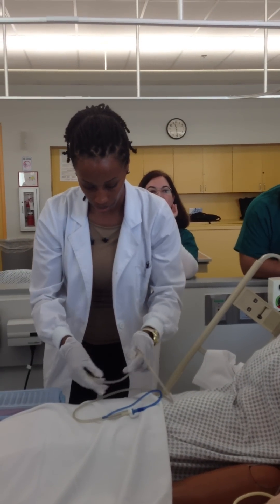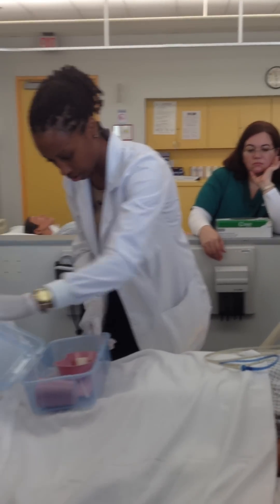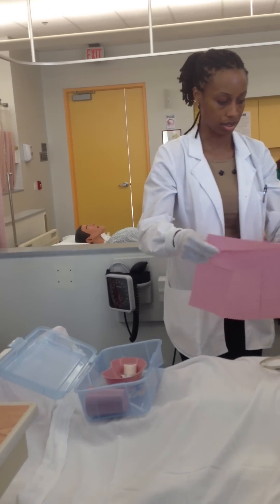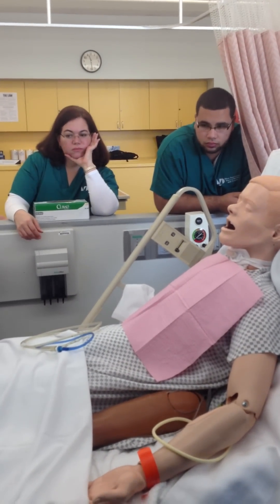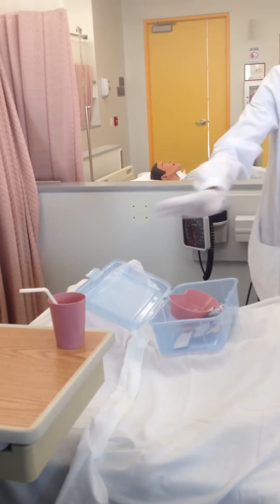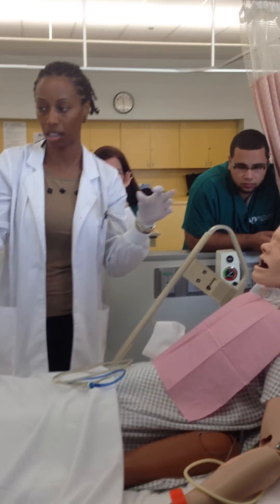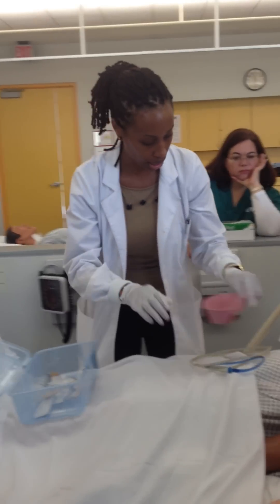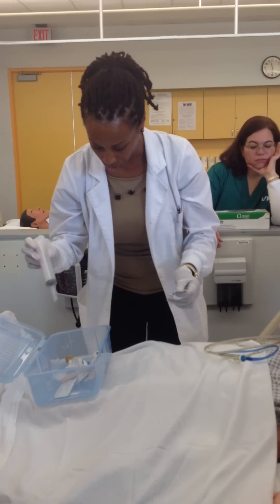This is clean, so you have it on the patient. If you have a towel, you can set it on top of the towel. You have a cup and straw for your patient — when it's time for them to take a sip, put it close to them and tell them to grab their cup and start taking sips, because you're really not going to be able to do both. You also have an emesis basin for the patient, then your lube and your syringe.